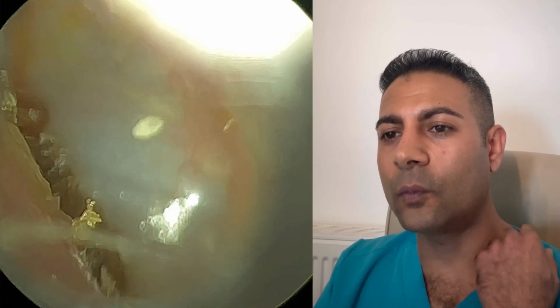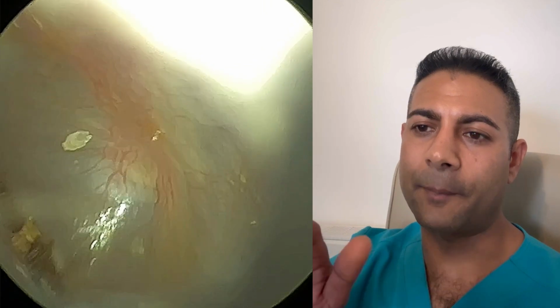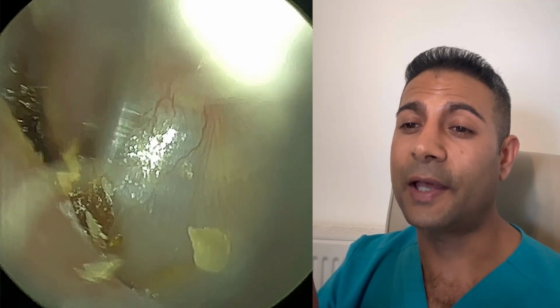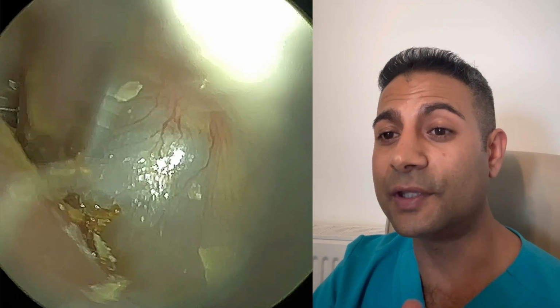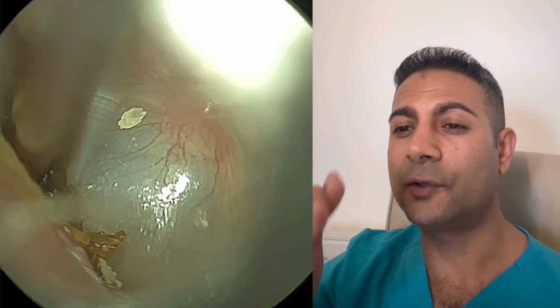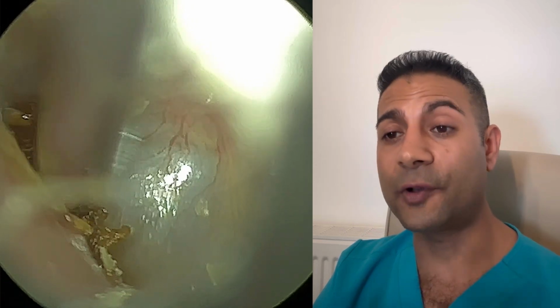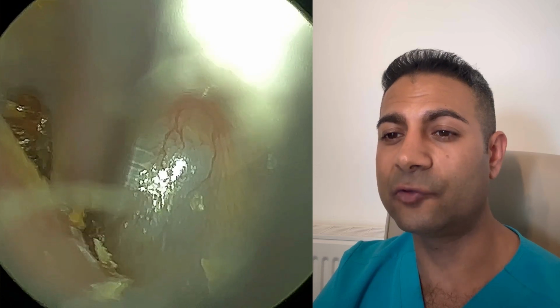Now, the eardrum is obliquely orientated, so about 1 or 2 o'clock on the eardrum is actually closer to the ear canal entrance. And then where I'm at the moment, around 7, 8 o'clock, the eardrum is actually offset deeper in the ear canal, and it gives the eardrum this oblique orientation. The tilt is around, I think about 30 to 40 degrees, so it's quite a significant tilt. And I don't know whether you were able to see that when I entered the ear, but you could actually visualize that oblique orientation using the WAXscope.